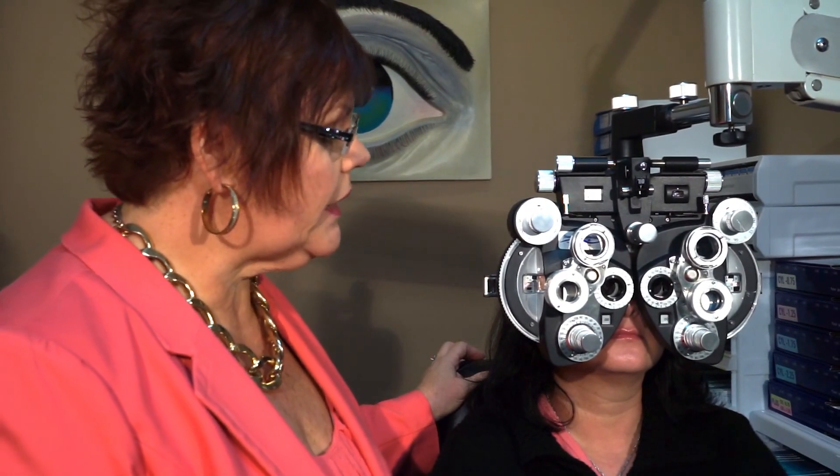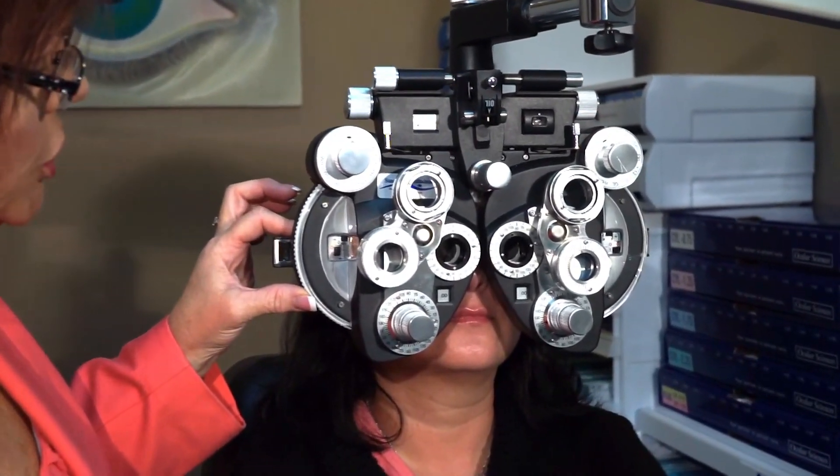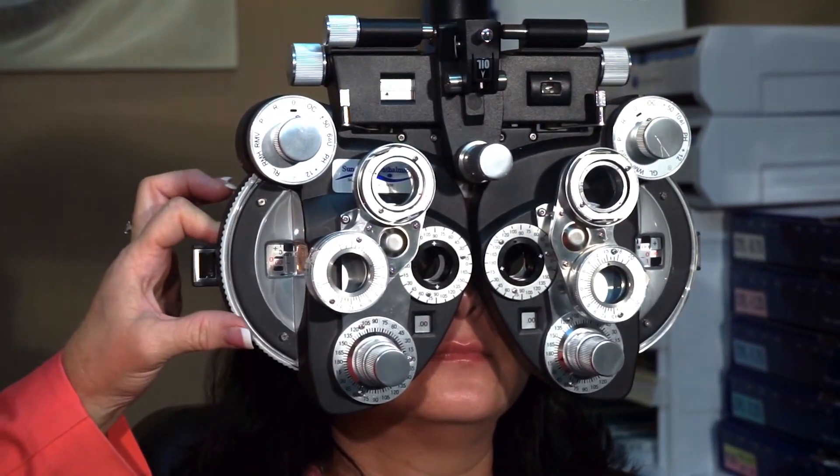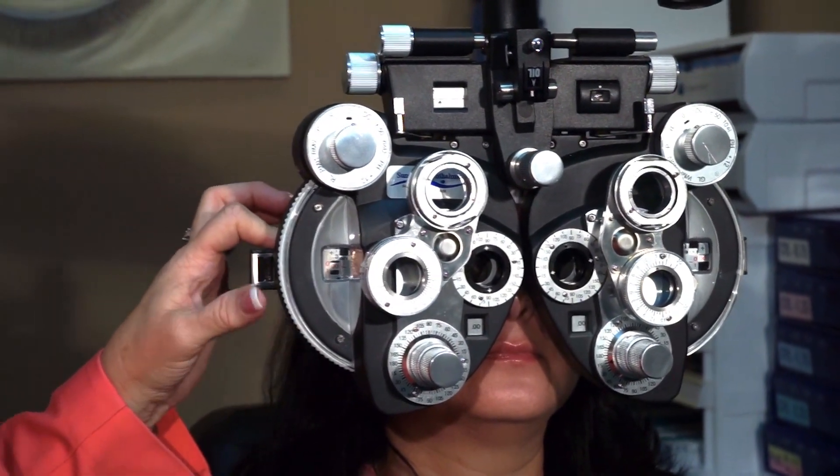I'm going to show you two lenses and I want you to tell me which of these lenses makes the letters the sharpest and the clearest. I'm going to start by offering her sphere in half-diopter increments, offering her more plus sphere first to relax her accommodation. I'm going to determine the most amount of plus or the least amount of minus sphere that she perceives to be clearest. Sharper and clearer with lens one or lens two? One. Lens three or lens four? Three. So I offered her more plus sphere and she rejected it, and I offered her more minus sphere and she rejected it. So I'm going to leave her at Plano.